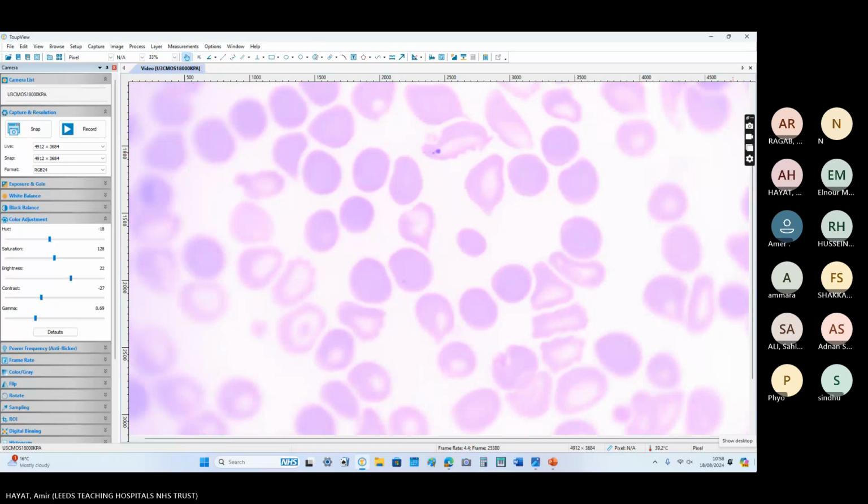As this patient has recently been transfused, do we still ask for HPLC or electrophoresis? In transfused cases, it is a bit difficult to find out the exact diagnosis, but you can send the blood for electrophoresis even, or wait for some time to make the diagnosis.